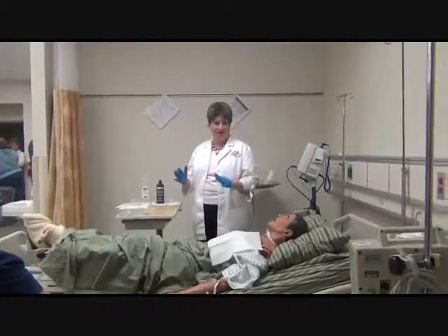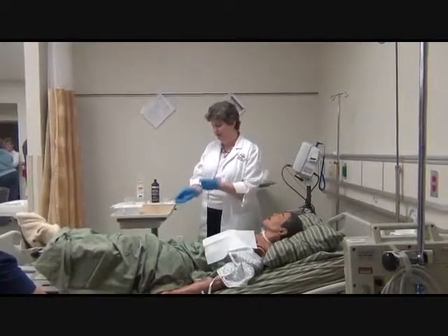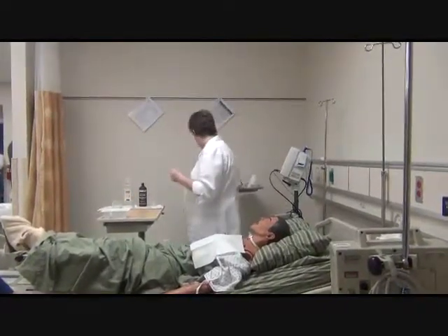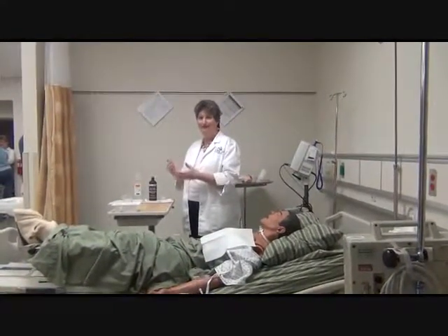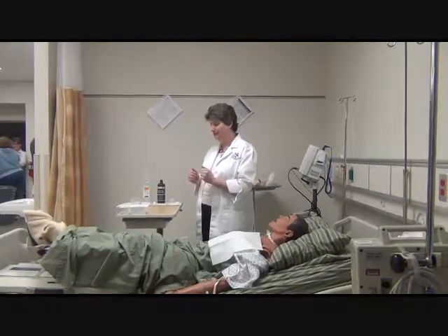So I now have on my clean gloves. I've removed my dressing. Now I need to prepare my sterile field. So I am going to remove those gloves and throw them in the trash can. I need to, again, clean my hands. We can use sanitizer at this point, or go to the sink and wash our hands. Make sure they're good and dry before you do.